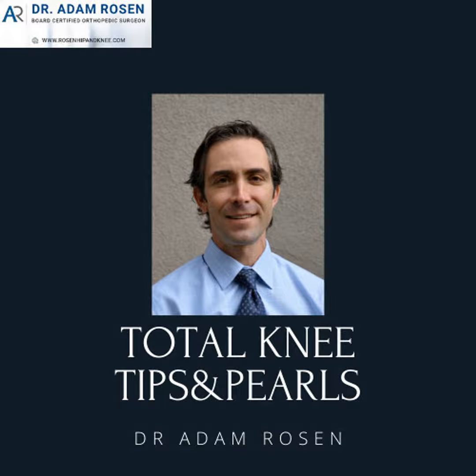So in today's episode, I want to start the beginning of a few episodes which are going to talk about total knee revision. The need or cause for revision is multifactorial, and there are many different combinations of things that you may deal with: periprosthetic fracture, aseptic loosening, septic issues with infection. You may have simple polyethylene wear or laxity.